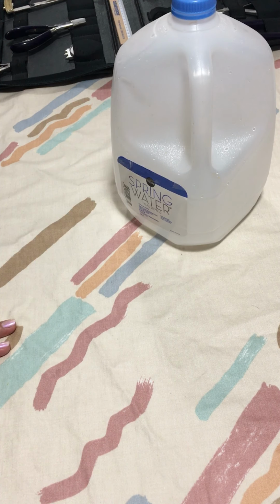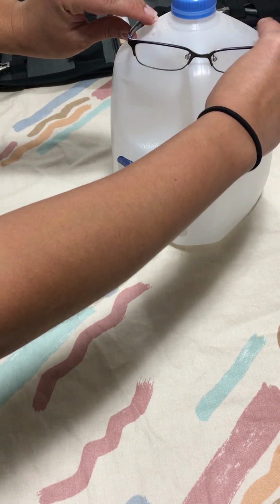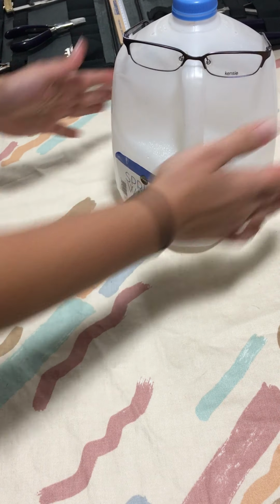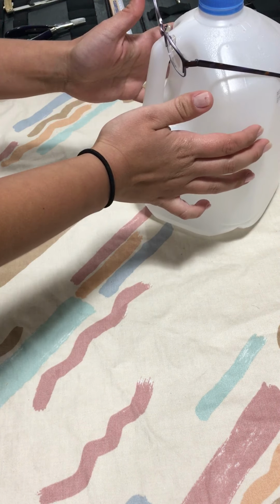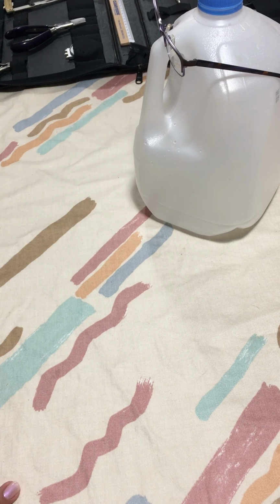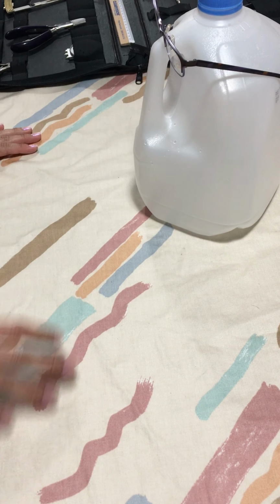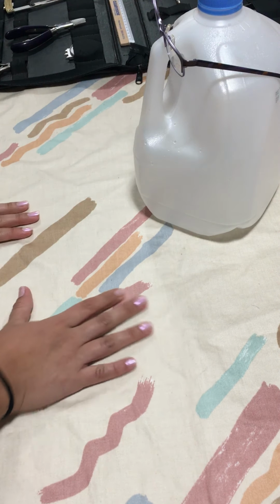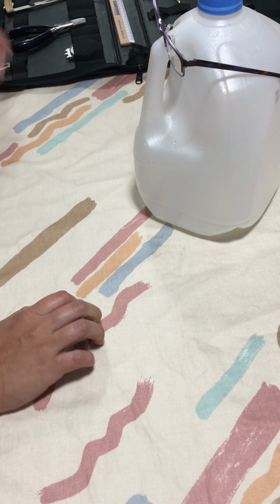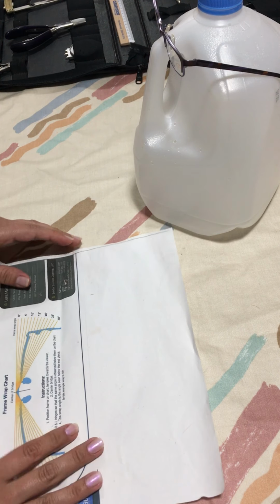The next alignment that we're going to be looking at is going to be this alignment. This alignment, we put it on, patient comes into the optical. What I notice on this alignment is, if I put it right here, facing me, what I notice is that it has too much pantoscopic tilt, okay? I am noticing that it has a lot more than what it should have, okay? So I could even check it with my little chart right here, okay?